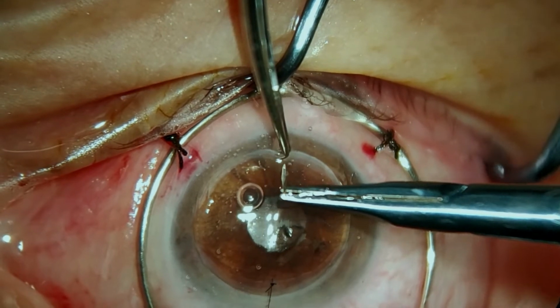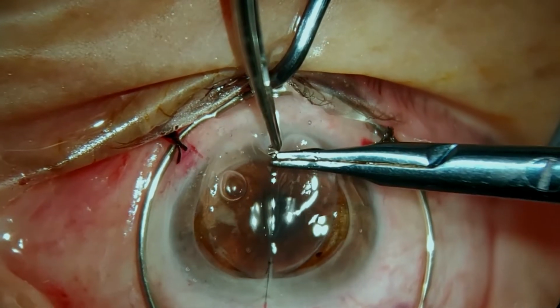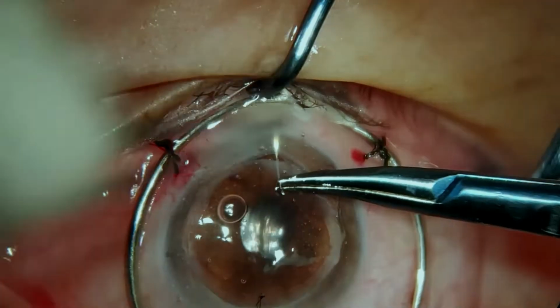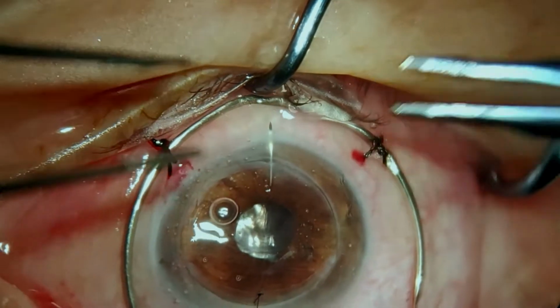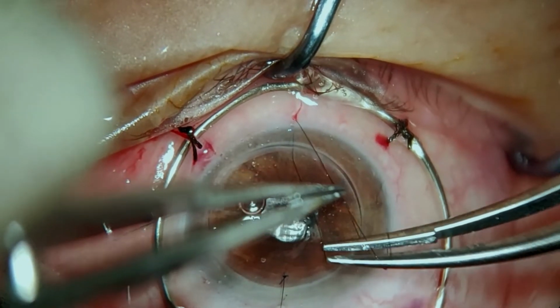The 6 o'clock suture is said to be the most astigmatically significant one, and of course that is the case. So it's always best to pay close attention to have as much cornea on the right side as you do on the left, so as to find a good balance geometrically between the two sides.